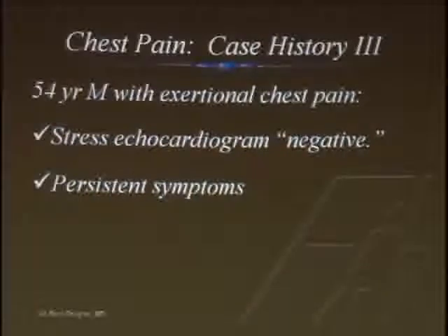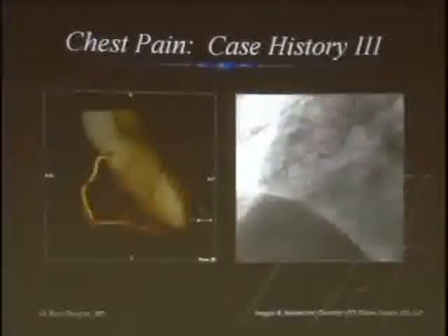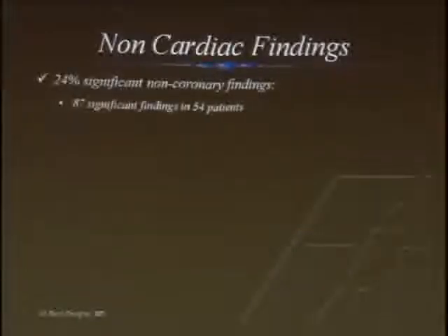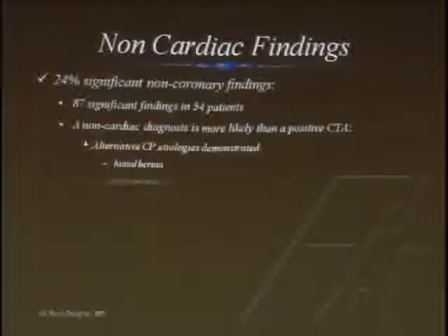No, that one. I just want to show the cine because it was just kind of a nice show. And I'll end after this one. No, I guess it's not going to run. Anyways, it was a cath that showed the right RCA stenosis. And then I think on time, just go. We'll just go ahead and fast forward. We're out of time here.